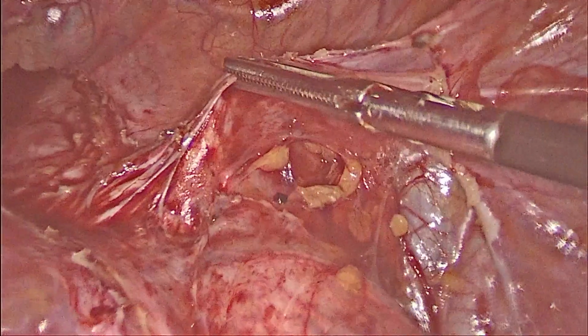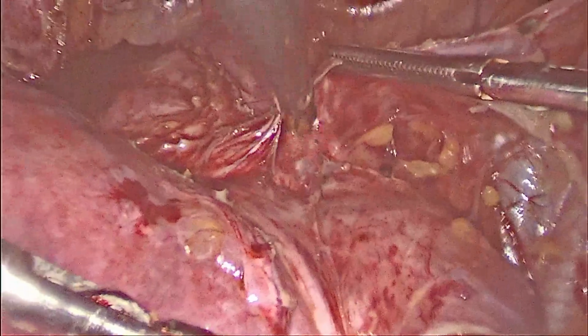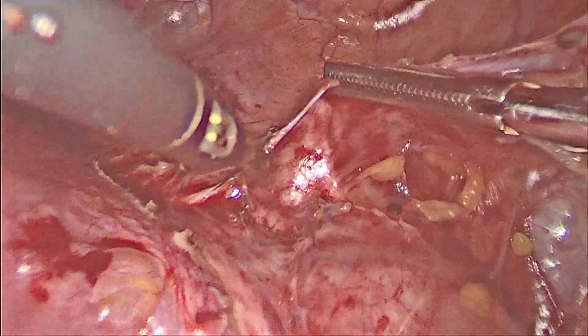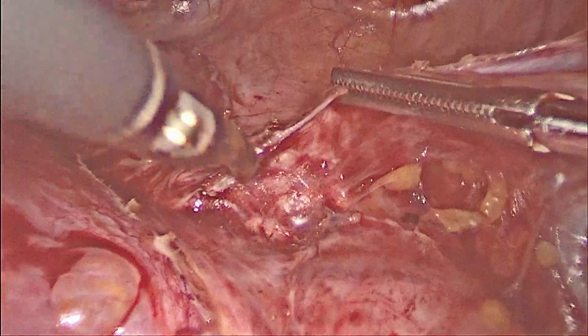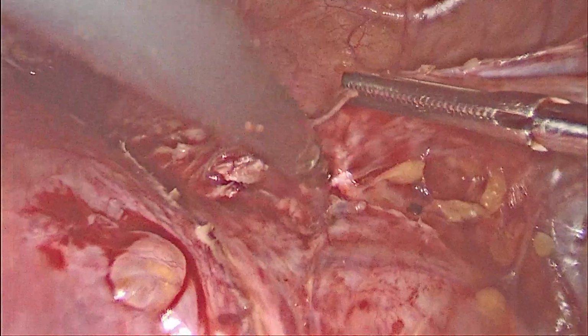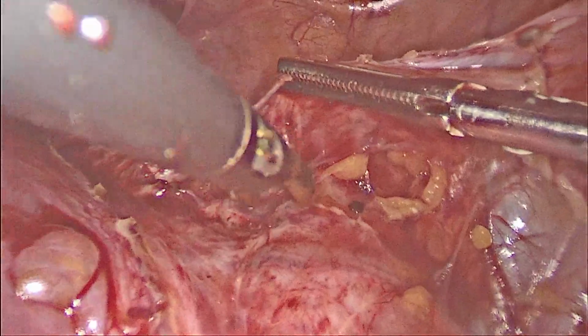Some part of the uterovesical fold of peritoneum is still remaining on the right side. So that is the completion of the dissection we are doing, so that the right side uterine vessels are tackled.